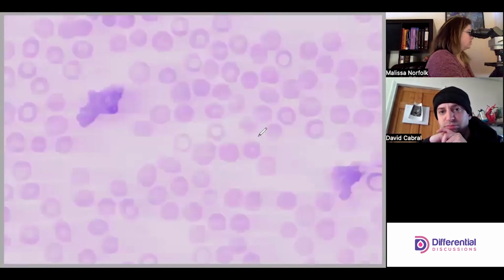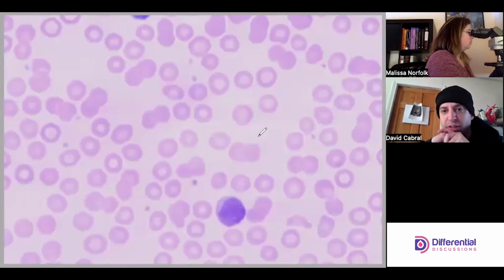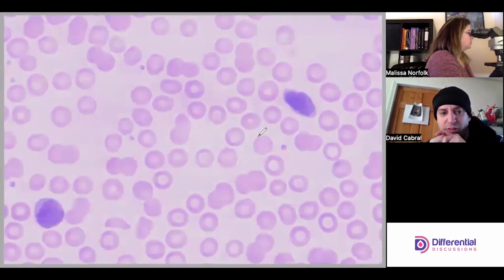Let's see. I'm just going to scan around quick and see if I see any others that are quite that nice. Oh, let's do this.